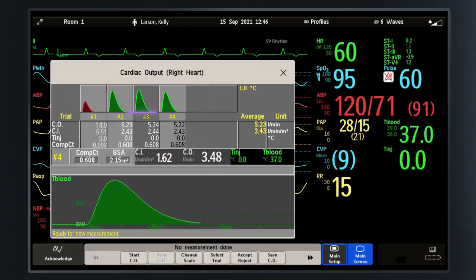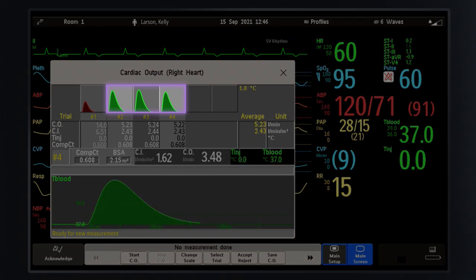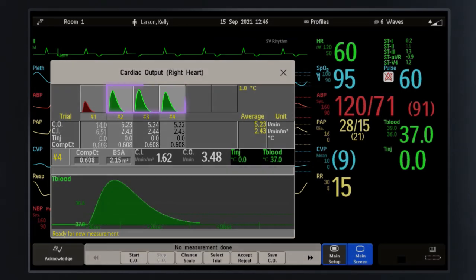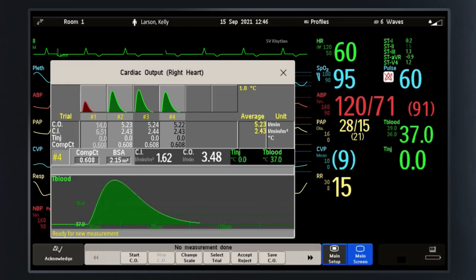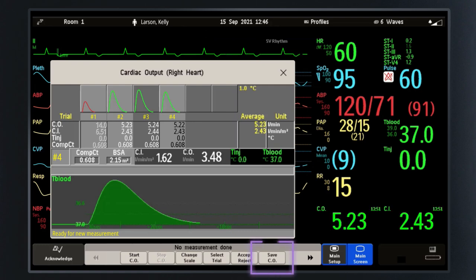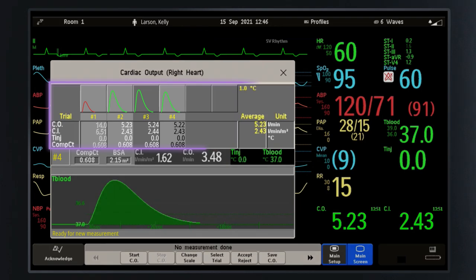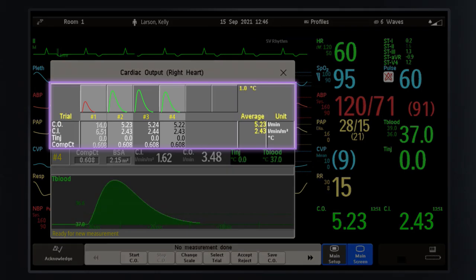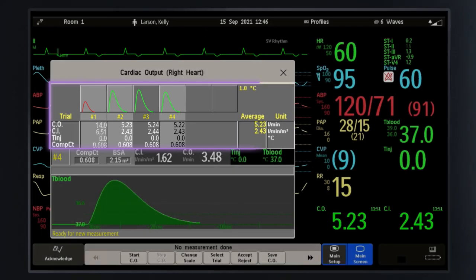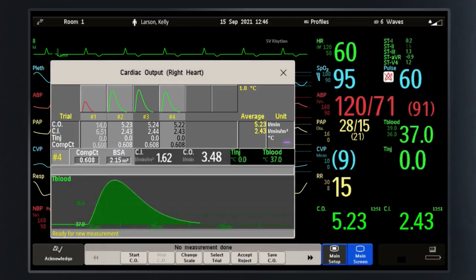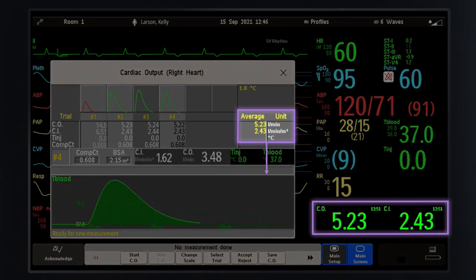Accepted trials are represented by green backgrounds. Once you have completed the required number of trials, select Save CO to save the averaged CO values. After saving the CO average, the measurement series is locked and the trials cannot be edited. You can see the averaged CO values are displayed on the main screen.